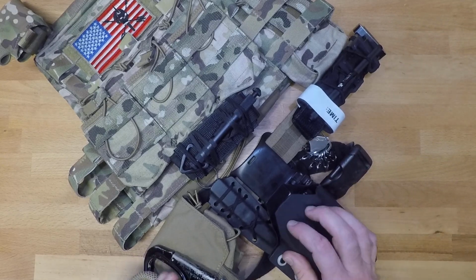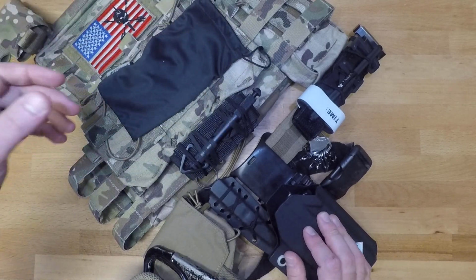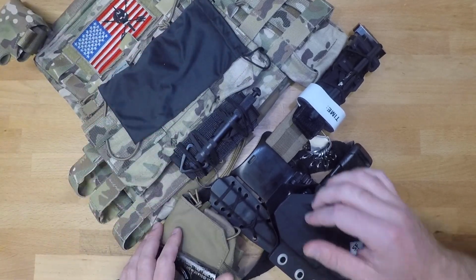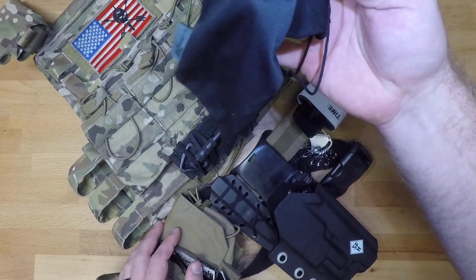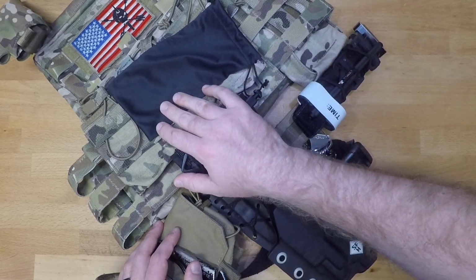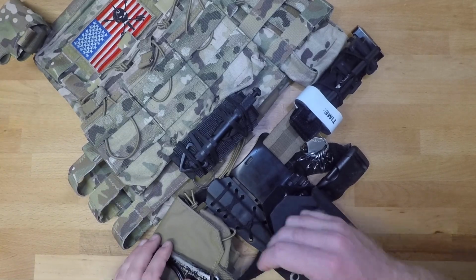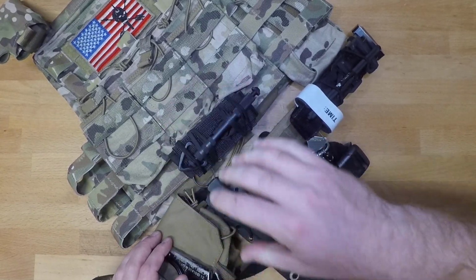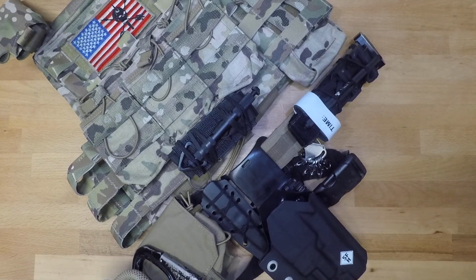When it comes to the argument over UV light damaging your tourniquets, the easiest and simplest way of setting up your tourniquet to protect it from UV light is just grab a $1 or $2 sunglasses case and throw that tourniquet inside of there, and then set it up on your kit. It'll protect it from the weather, the elements, the UV light, and all of that, to where you don't have to worry about it. I know some guys will argue that they don't want to have that tourniquet inside of a pouch or a pocket, whatever the case may be.